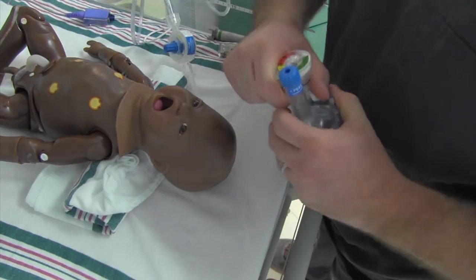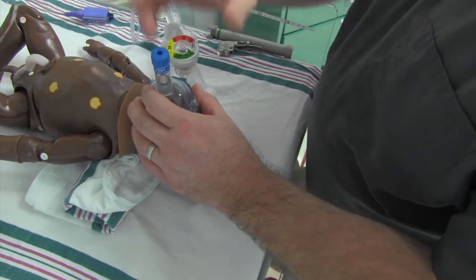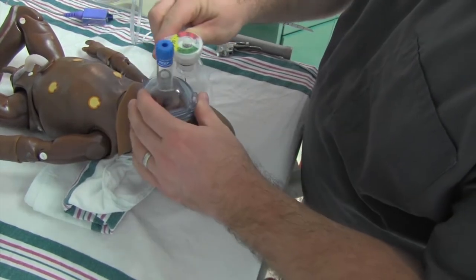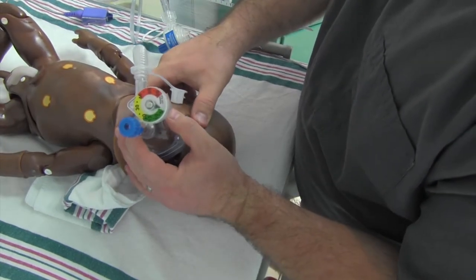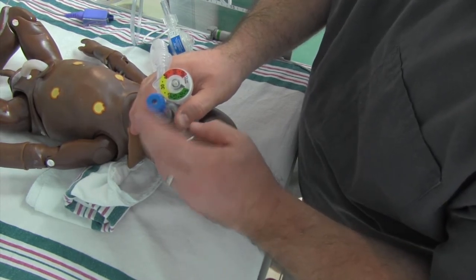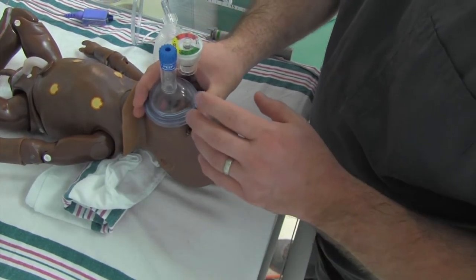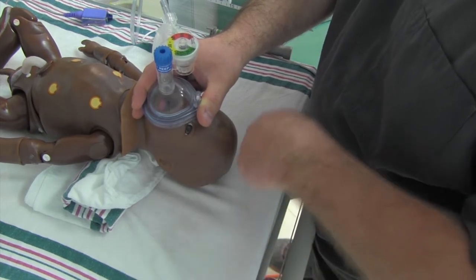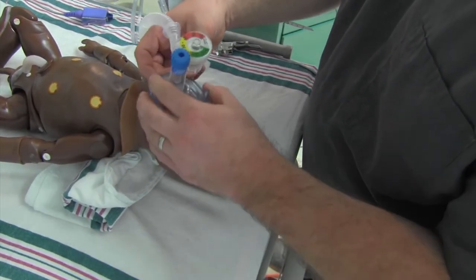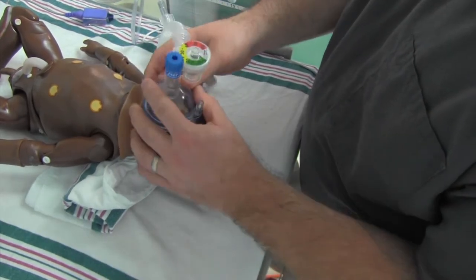The simulator's not turned on right now so he has no heart rate, so what we're going to do is start positive pressure ventilation. I need to get a good seal and note the time on the resuscitator because I want to look at 30 seconds from this time to reassess. So we're going to seal this on - that's where the nose goes right there. If I'm trying to ventilate and it's not going up to 20, you do what they call MR. SOPA - an acronym: M-R-S-O-P-A. M is the mask - is the mask fitting? Do I need to readjust it? So mask and readjust, M-R. We're going to readjust the mask - sometimes you get a little funkiness in one of these seals.